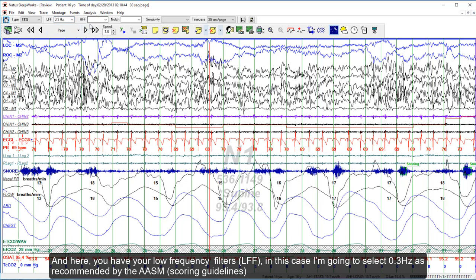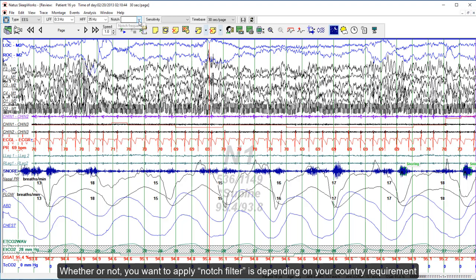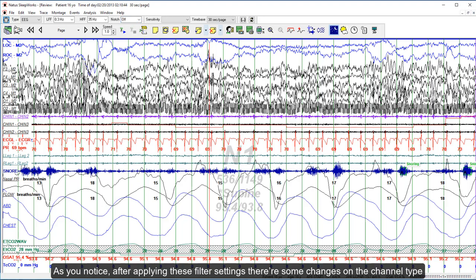For the high frequency filters, I'm going to select 35 Hertz. Whether or not you want to apply the notch filter depends on your country requirements — otherwise you can turn it off where necessary. After applying these filter settings, you will notice some changes on the channel types.